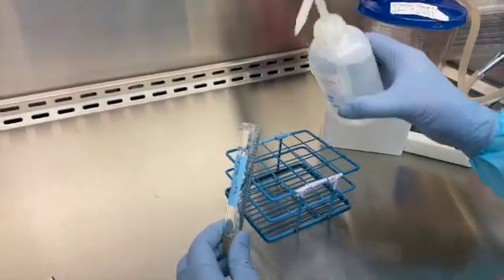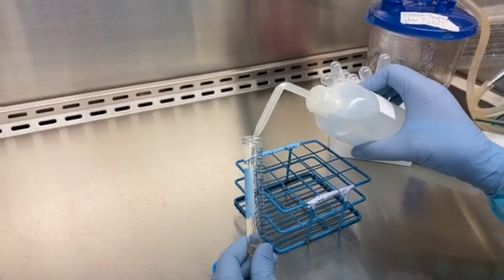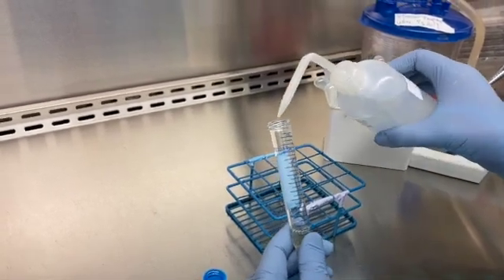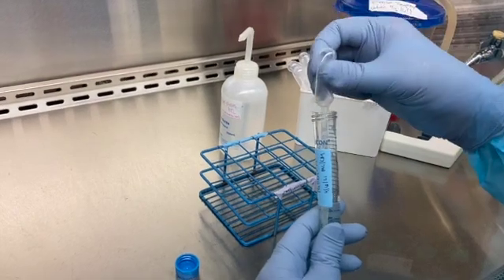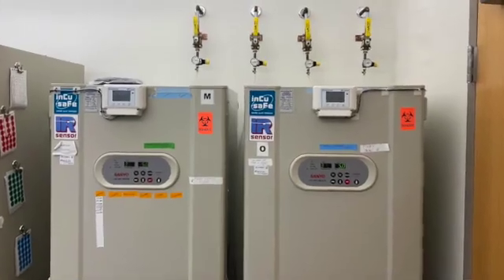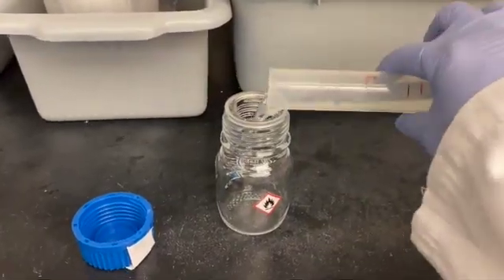Add hypotonic solution to the sample dropwise, going roughly up to the 5 ml mark. Gently agitate the sample as you add the hypotonic solution. When you're done adding hypo, mix the solution gently up and down with the transfer pipette. Incubate the sample for 16 minutes. In the meantime, make fresh fix and place it on ice or put it in the freezer to chill.